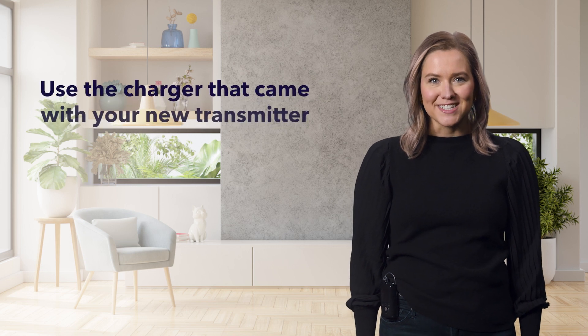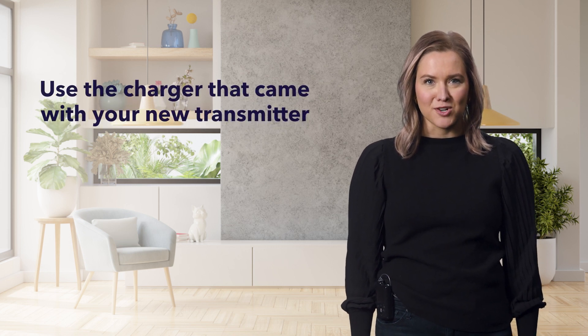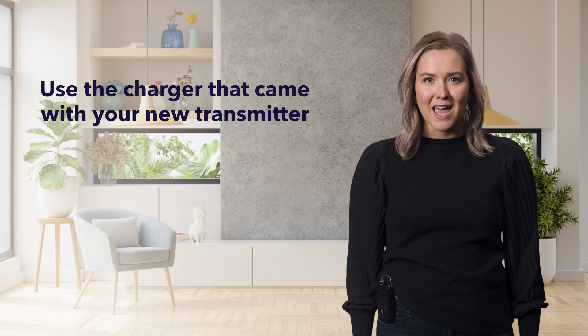Also, it's a good idea to use a charger that came with your new transmitter instead of using any old ones you may have laying around from a previous system. Let's review the charging process next.